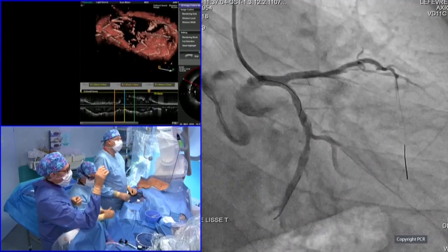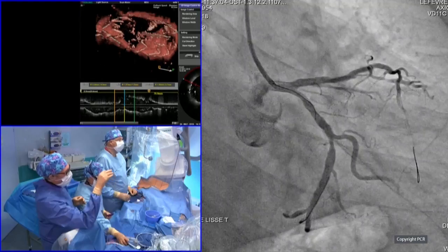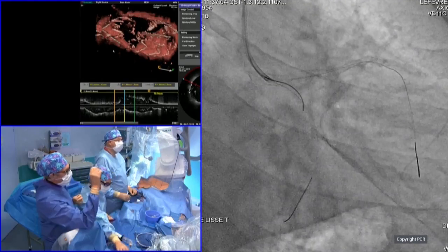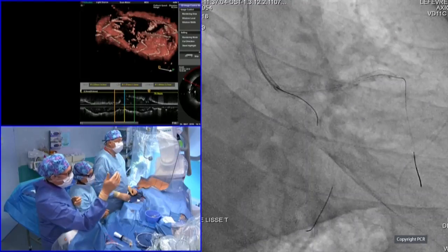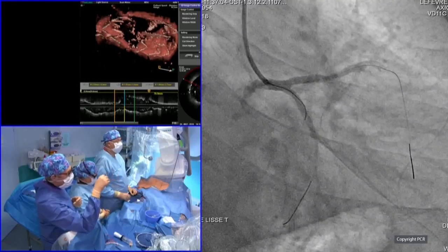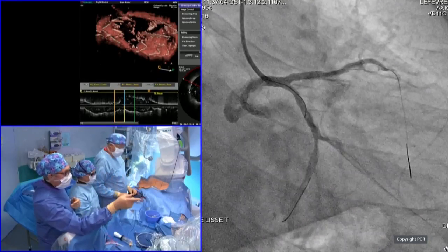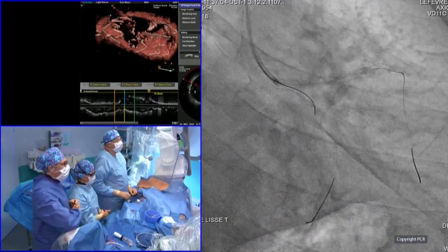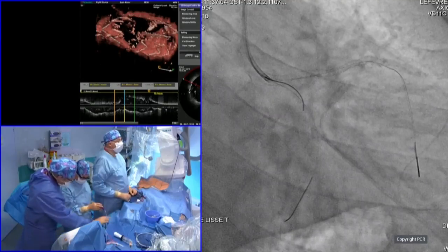Thank you. So you see on the screen that we have the radio-opaque part of the wire, which is distal to the non-radio-opaque part of the previous wire, which is the gel wire. So it's clear that now we are more distal than before. Can you zoom on that? The two wires are not superimposed. Can we zoom on this? Yes, we can do it, if we find the right button.